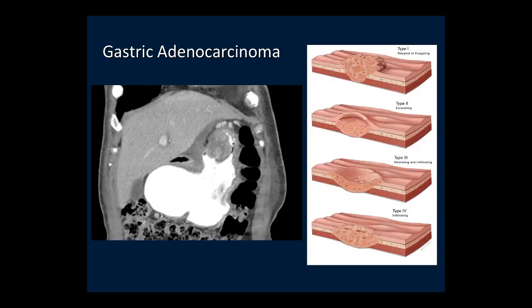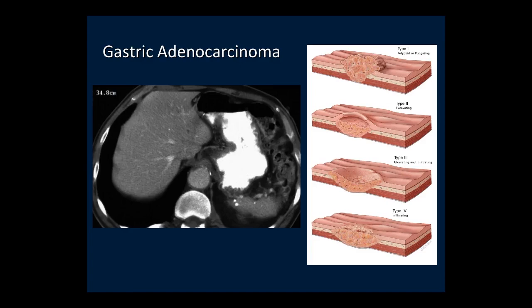For larger adenocarcinomas, there are four basic patterns. The large polypoid or fungating mass is an irregular mass with heterogeneous CT attenuation. The ulcerating or excavating adenocarcinoma is a mass where the majority is ulcerated, leaving only a thin rim of soft tissue. It is more common on the lesser curvature. We see thickening of the lesser curvature with a large ulcer crater, which can be very difficult to detect on CT if the stomach is not well distended.